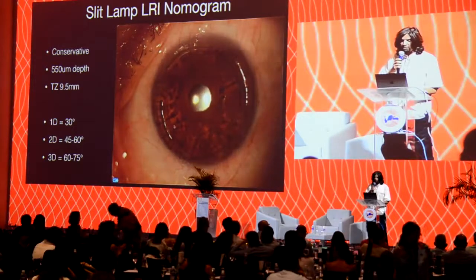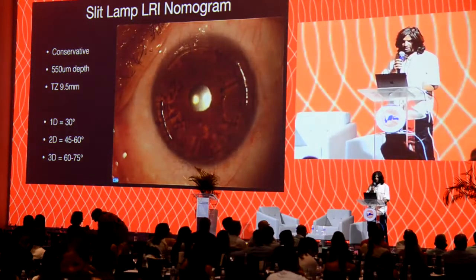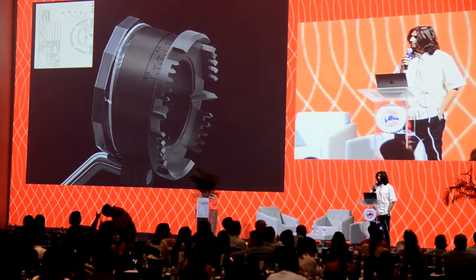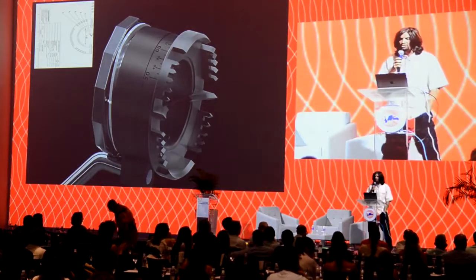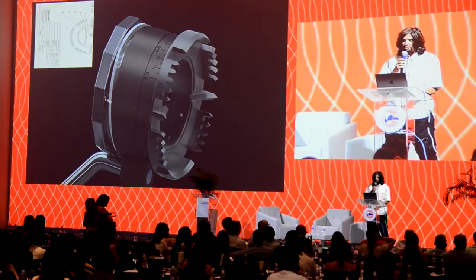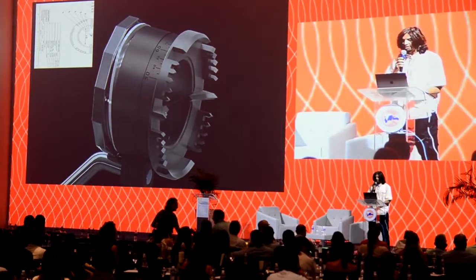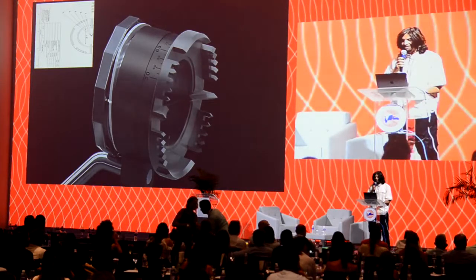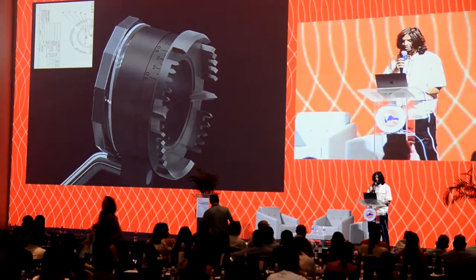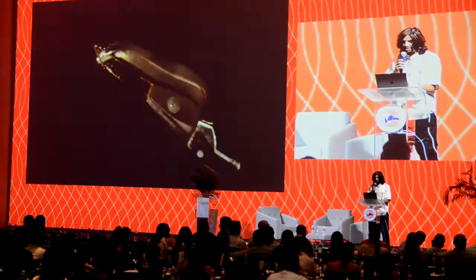And you'll see I have some marks on the cornea where I placed my corneal incisions. These marks come from this specially designed marker. This is from Mastel, like I showed yesterday. And we have two rays where we line it up on the steep axis of the refractive cylinder, and each of these little teeth can give us a guidance how wide to make the arc. This would be 30 degrees. Between the second teeth, it'd be 45, and 60, 75, and 90.